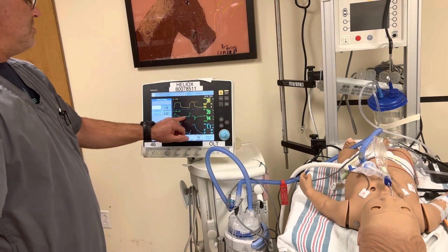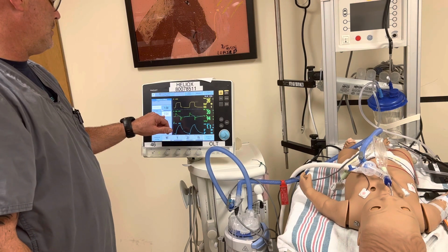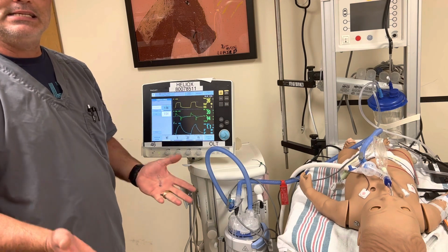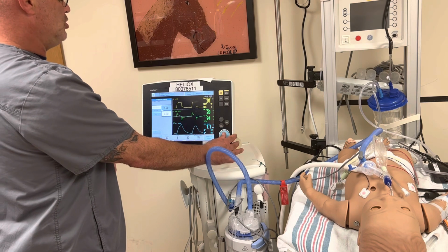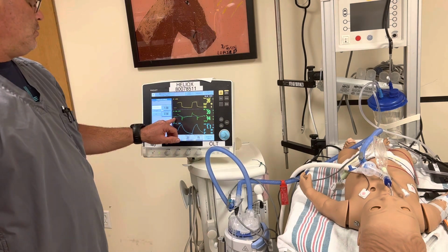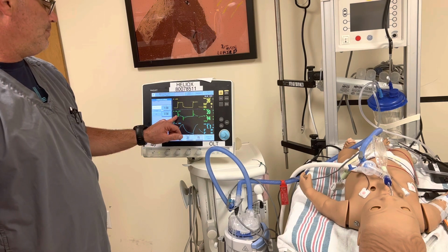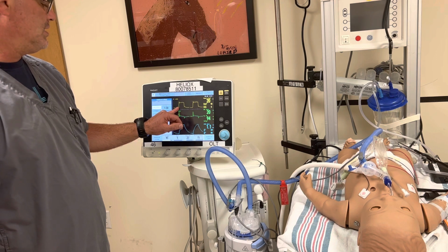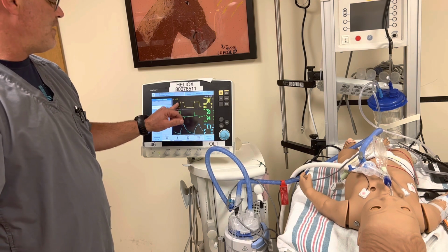The next thing we're going to do is the rise. Our policy guidelines say our goal for our rise setting is to get a decelerating waveform on the patient. If I set my rise time too fast, you see what will happen on the waveform. You'll get a very sharp spike on the beginning flow. The rise time controls how fast the vent is attempting to get from its PEEP to its peak airway pressure. How fast are you going to get there?